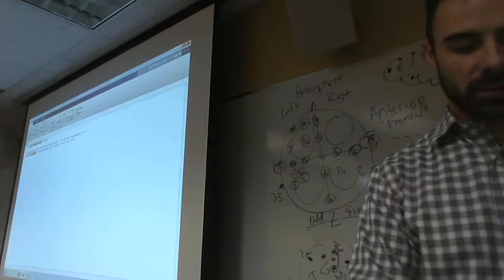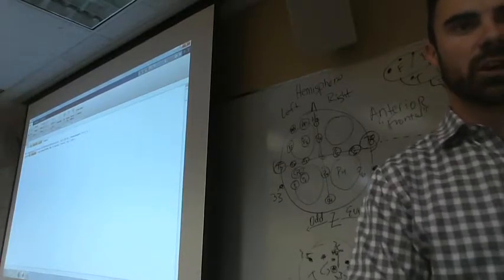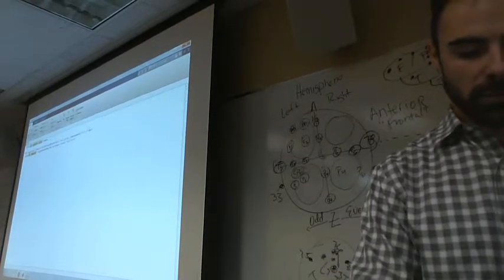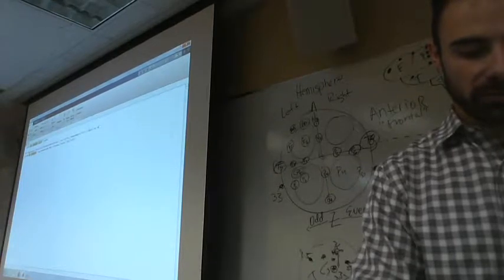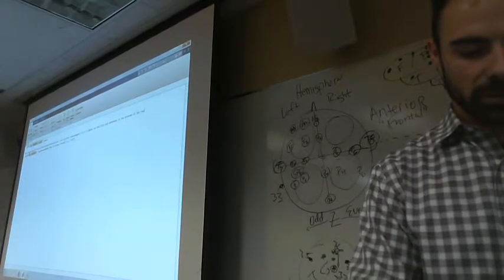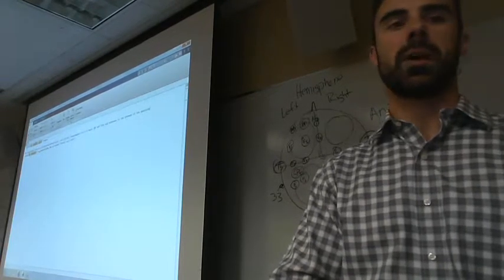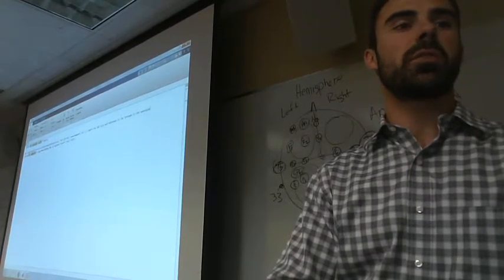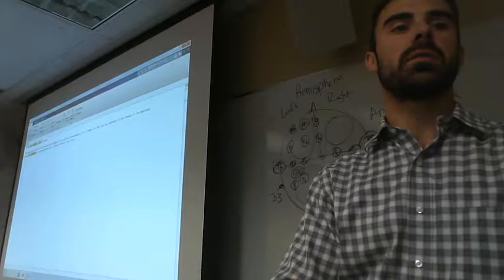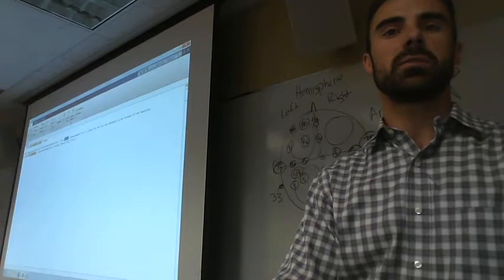Okay, on the right-hand side, we can do a percentage sign, which is commented out, which allows us to type in a note. So I'm going to type a note to myself that says import raw BDF file and re-reference to the average of the mastoids. That way I don't forget what I did with that command. And so we can look and see this purple thing here in parentheses. That's our directory here. And then this is our file. And then it's asked us for our reference ones, and we fill that in. So that's what we did.